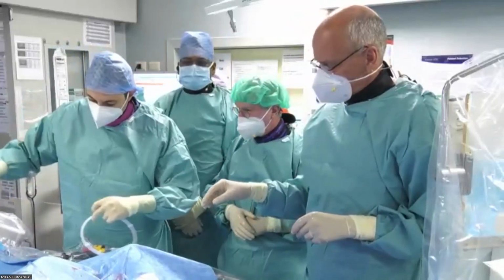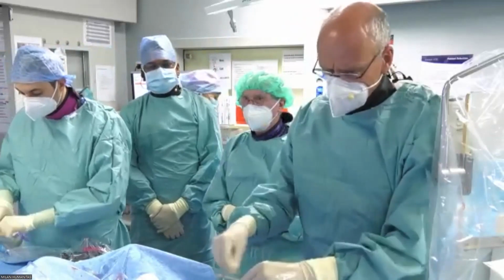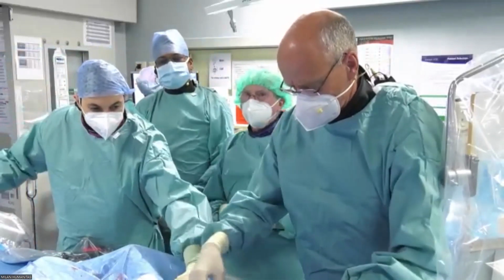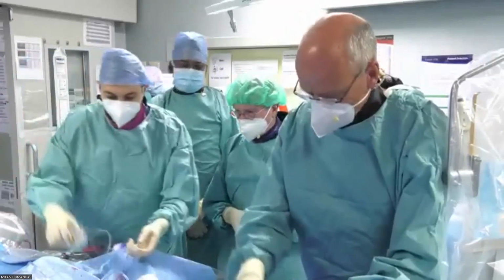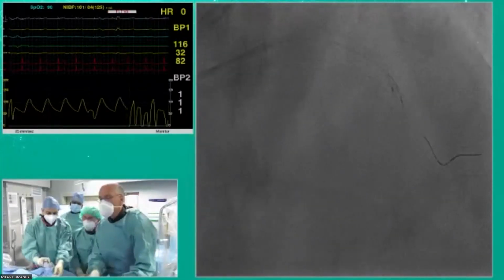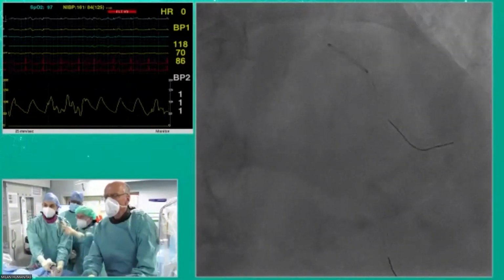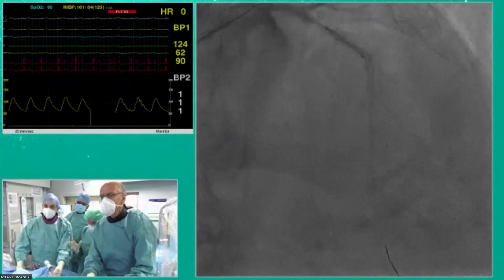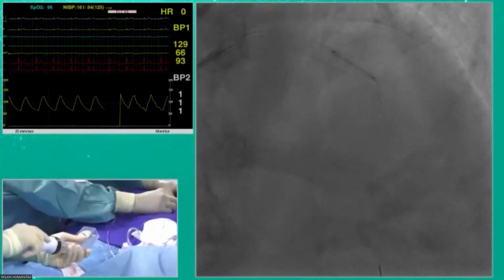Ajay, this is Ashish. How are you doing here? I have a question related to the future, in terms of newer bioabsorbable stents versus this type of result with drug-eluting balloons. In other words, what does this do to the magnesium-based scaffolds and other scaffolds with thinner struts that are on the horizon? That's a question for Antonio as well. It's a great and very important question. If you had a new generation bioresorbable magnesium scaffold, DREAMS, 100 micron, would you place the stent distally? No, even if I had a bioresorbable, because the gain over a well-done DCB is questionable. So I will not place a bioresorbable stent distally. If I have to place it, I may place it proximally, but not distally.